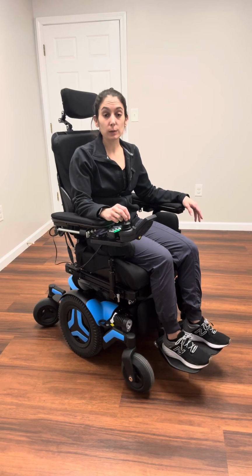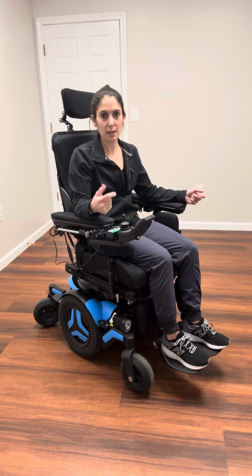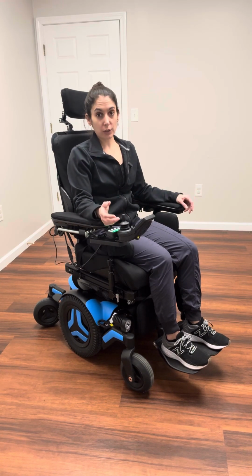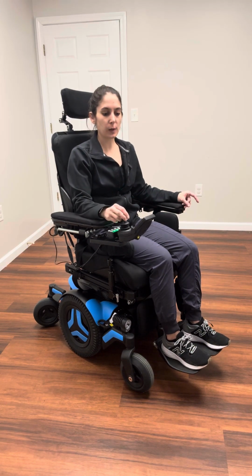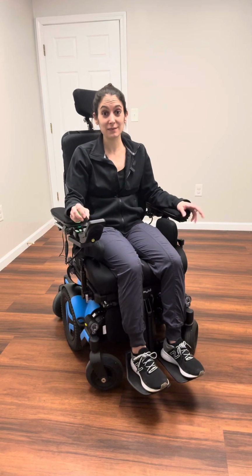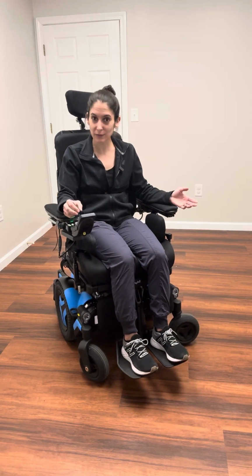Another thing to think about too is just in general the feel. As you are driving them and moving them, they do have a slightly different feel. So it could be a scenario that you just trial different chairs and one drive system just feels better to you. So that's why it's also important to trial it. I do recommend taking the time to trial them in different opportunities. Trial them in your house if you can.